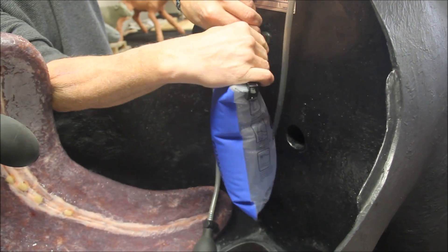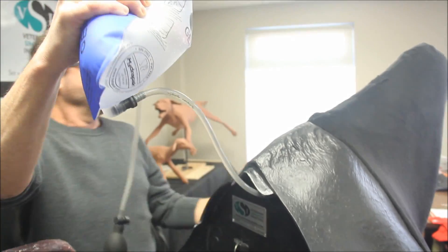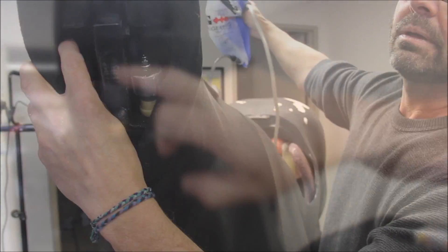On the initial setup, lift the bag while depressing the valves at the top of the horse neck until some fluid is released. Then reclip the bag inside the horse.